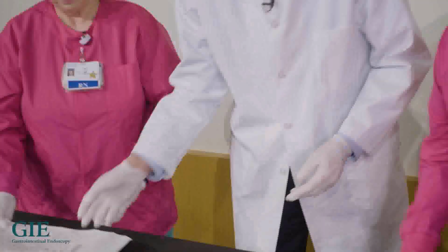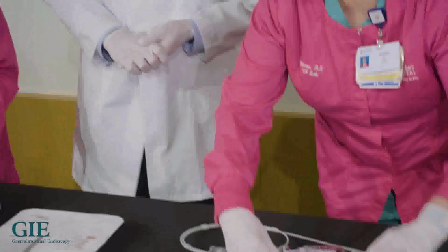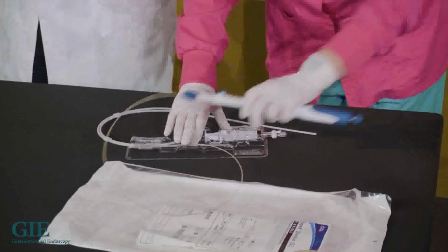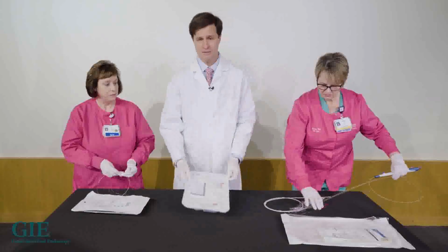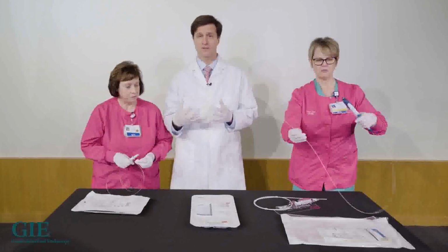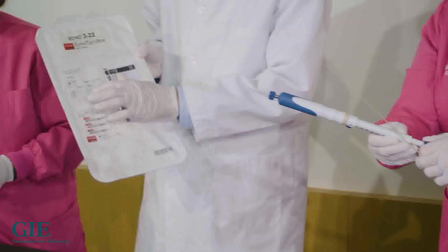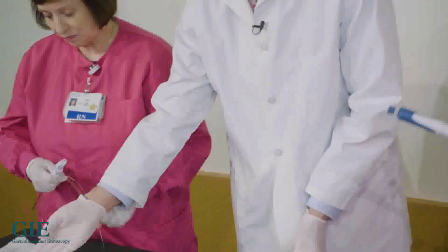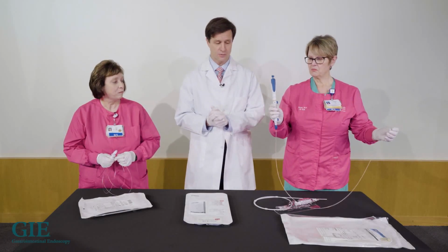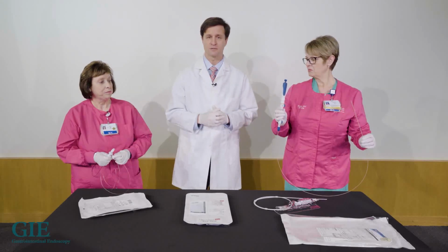So I'll have Pat have that one, and Karen has our 19-gauge EUS needle that we're going to put the forceps through. We cannot use a 22-gauge needle because the diameter of the channel through this needle doesn't fit these forceps. Look at the outside of the pack if you have questions for whatever your equipment is. Again, this pack will show that this is only 0.72 millimeters that it'll fit, and this pack says this is 0.9 millimeters, so clearly it doesn't fit. So make sure you know what equipment you're going to use, but once again, use the 19-gauge needle. We use the Expect Slimline needle from Boston for this.